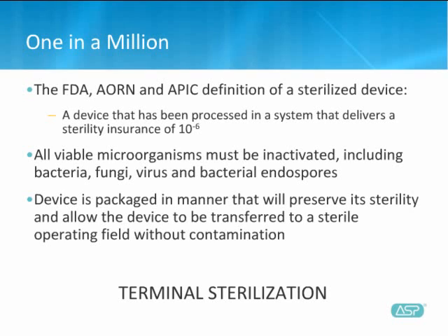High-level disinfection processes are typically used for semi-critical devices at the intermediate level of risk that may touch non-sterile tissue, such as GI and respiratory equipment. For situations that are a low risk to patients, cleaning and drying and possibly the use of a low-level disinfectant would be appropriate.